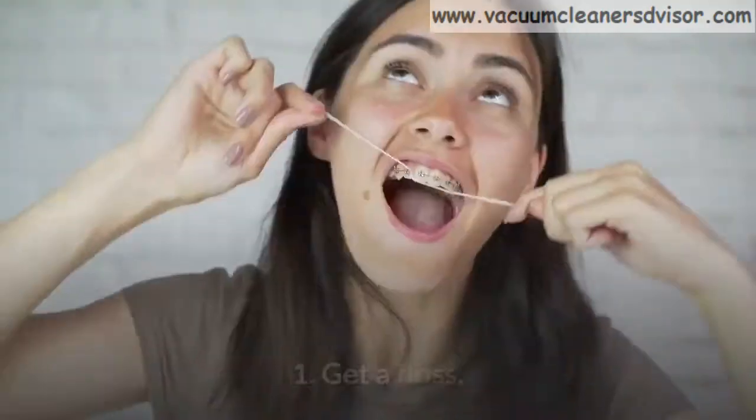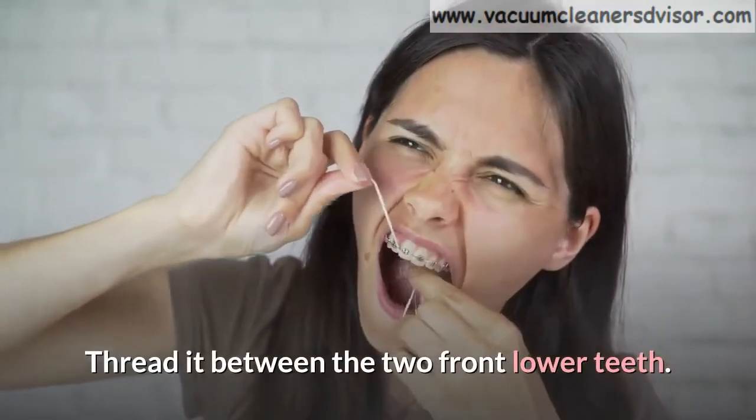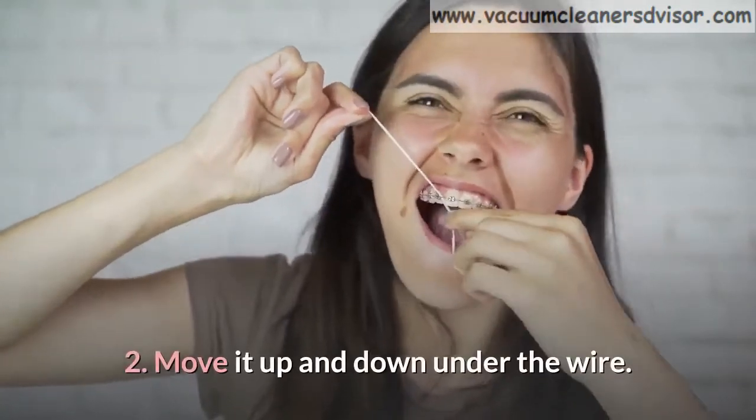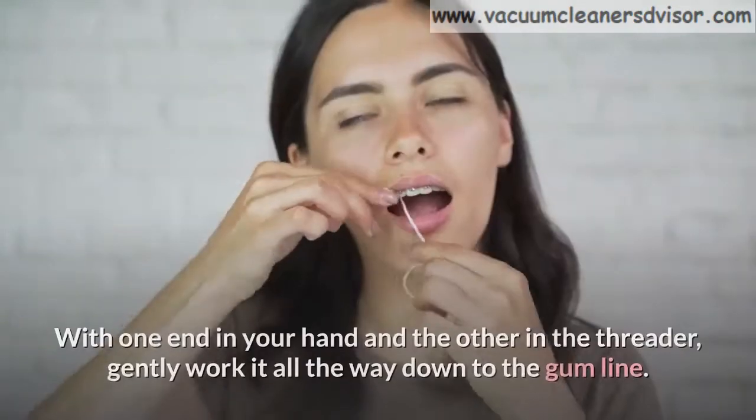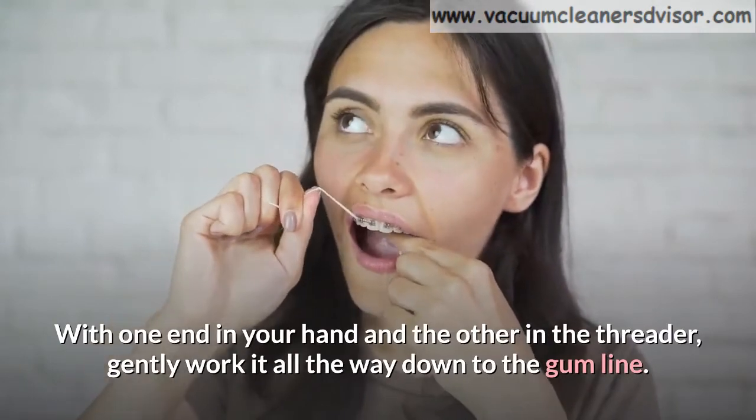Here's how. Step 1: Get a floss. Thread it between the two front lower teeth. Step 2: Move it up and down under the wire. With one end in your hand and the other in the threader, gently work it all the way down to the gum line.